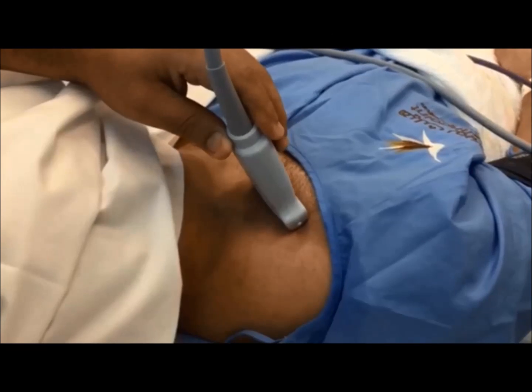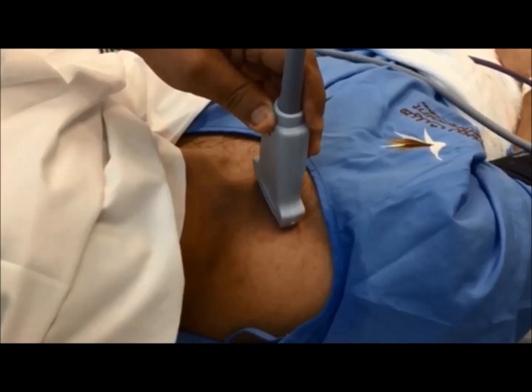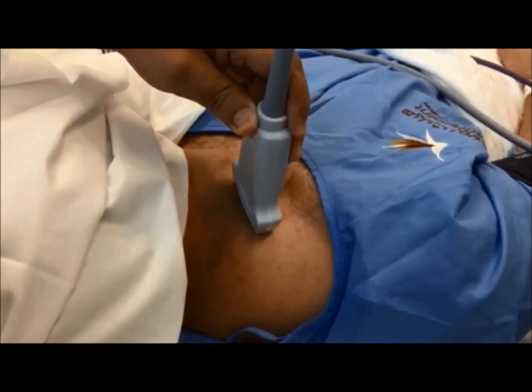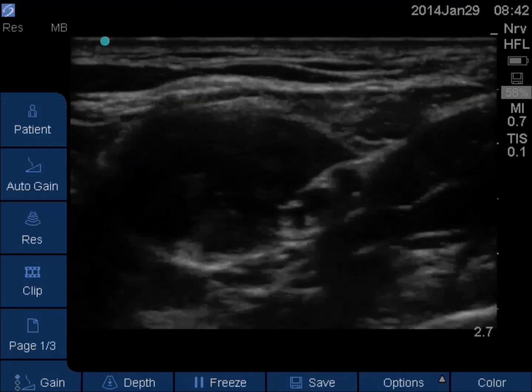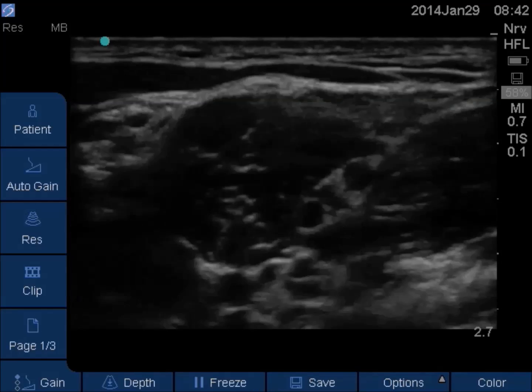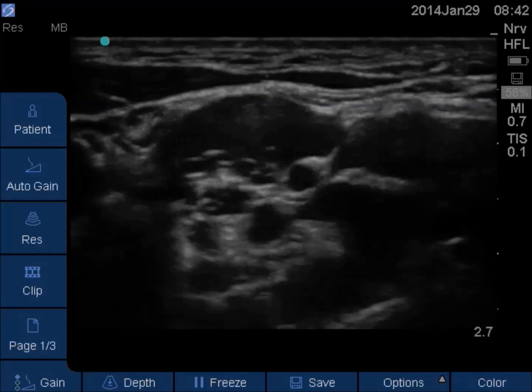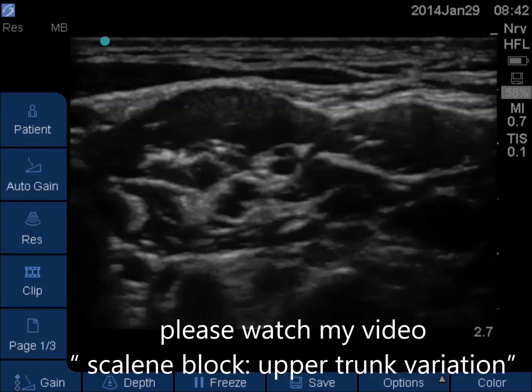Once you identify the artery, tilt the probe slightly and then slide it proximally. While sliding the probe, fix your eye on the brachial plexus. At the desired level, stop the probe. With proximal sliding of the probe, usually — but not always — the roots and trunks of the brachial plexus can be seen between the two scalene muscles.